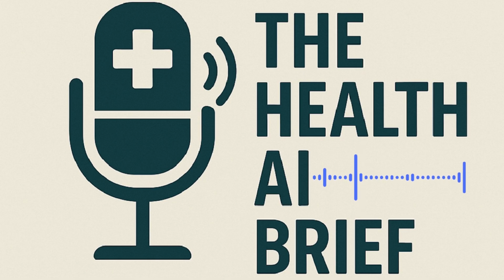The answer lies in the languages that they speak. For systems to connect, they need a shared, rigidly defined language or a standard. Today we're talking about the three most important ones you may come across: DICOM, HL7 and FHIR. So let's first talk about images. The standard here is DICOM.